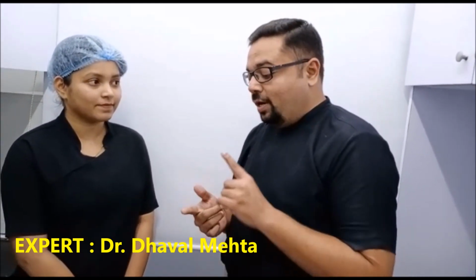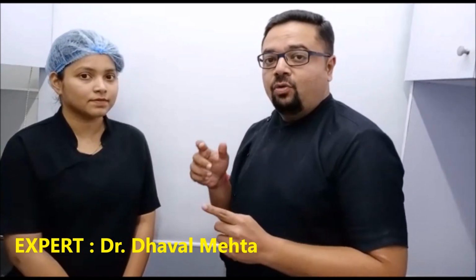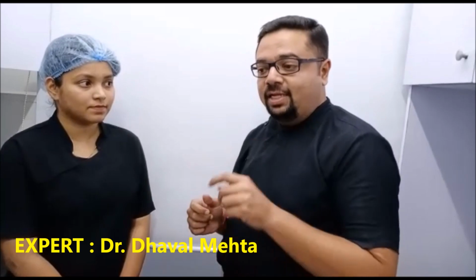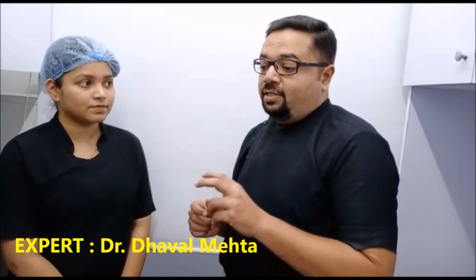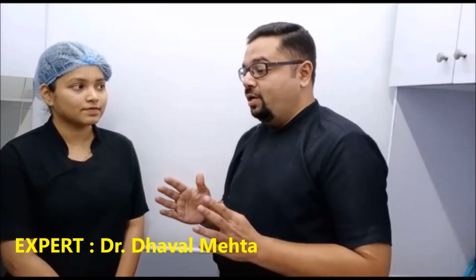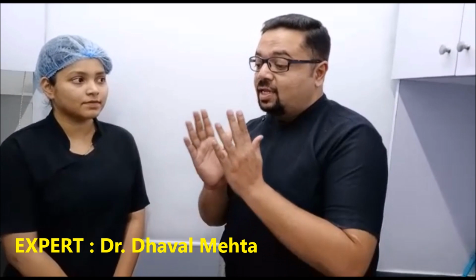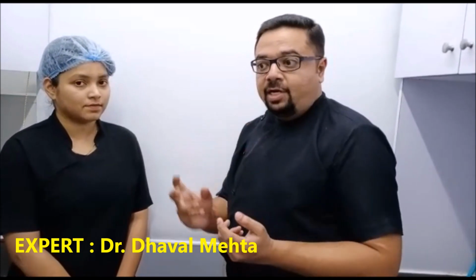But if you have a choice, when you are working with a single-rooted tooth and you are extracting the tooth and at the same time placing the implant, then in some cases grafting is mandatory, and in some cases we can avoid it. So in which cases can we avoid it? There is always a discrepancy between the implant shape and the socket shape.